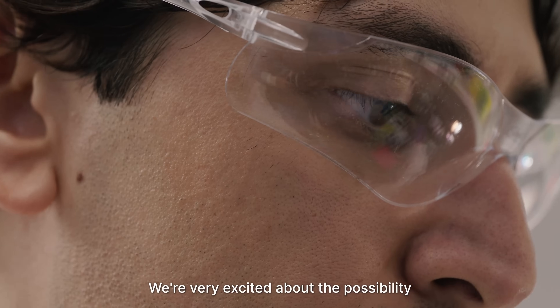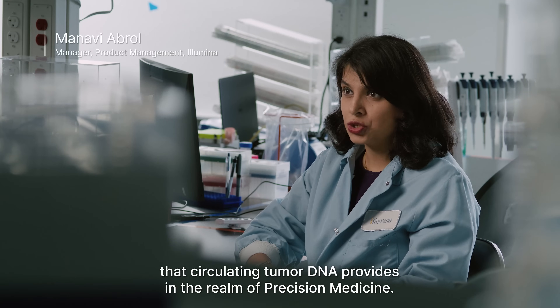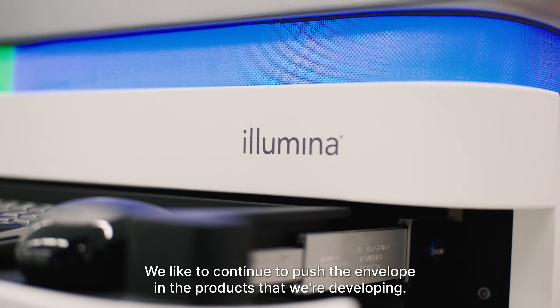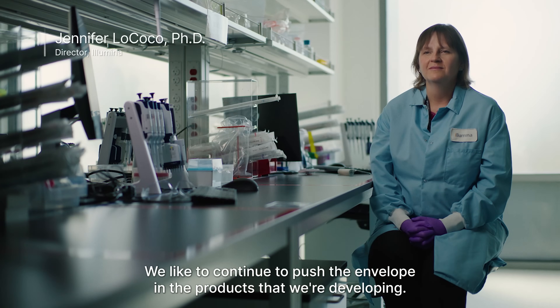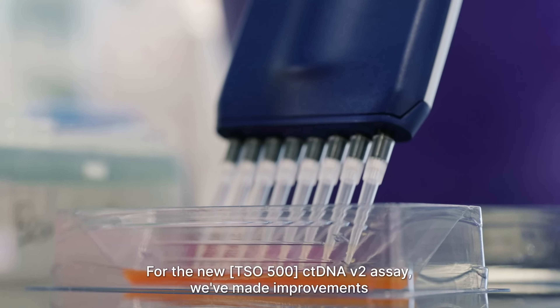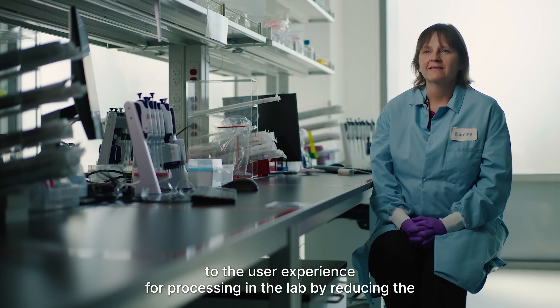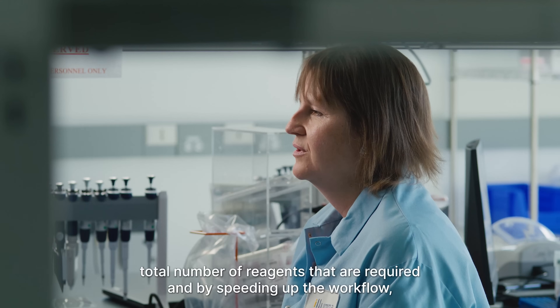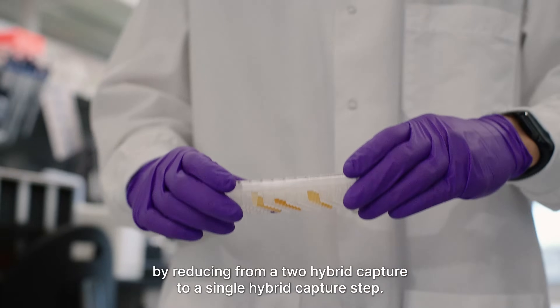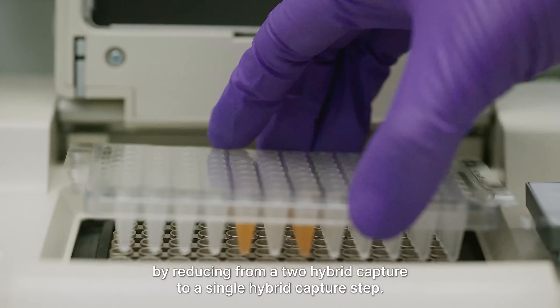We are very excited about the possibility that circulating tumor DNA provides in the realm of precision medicine. Illumina is very innovative — we like to continue to push the envelope in the products that we're developing. For the new ctDNA v2 assay, we've made improvements to the user experience for processing in the lab by reducing the total number of reagents required, and by speeding up the workflow by reducing from a two-hybrid capture to a single-hybrid capture step.